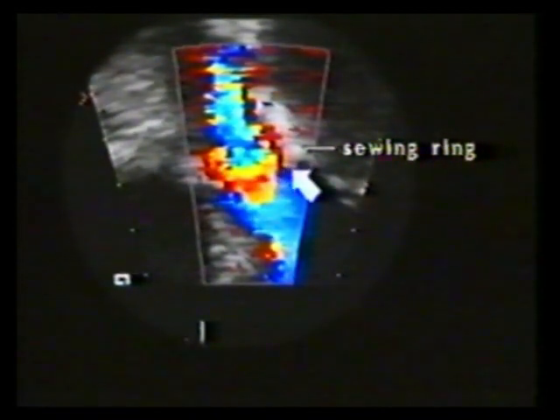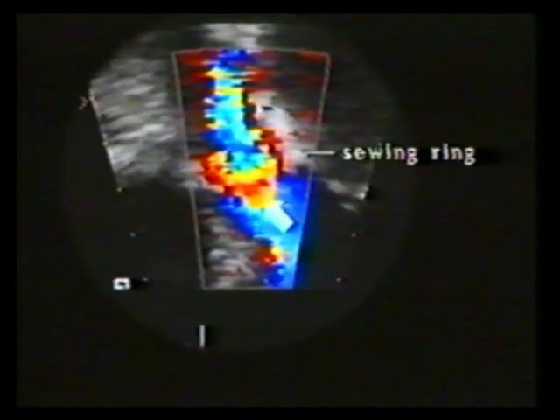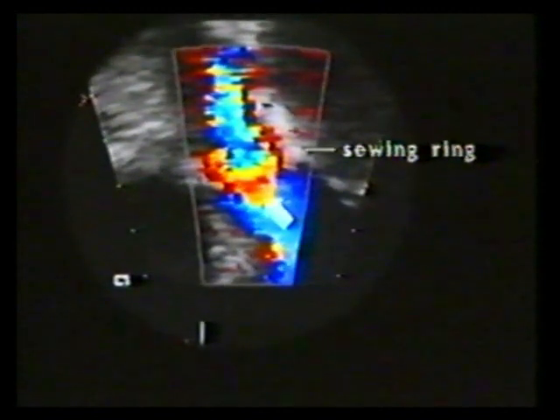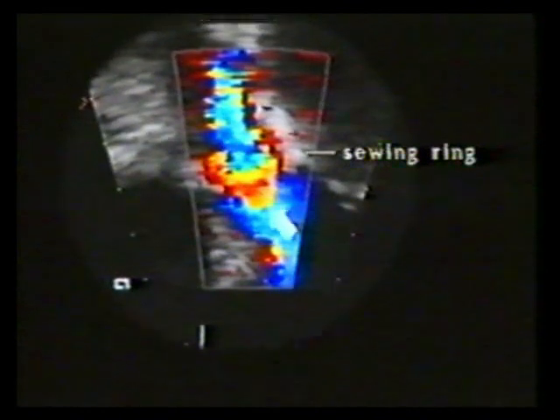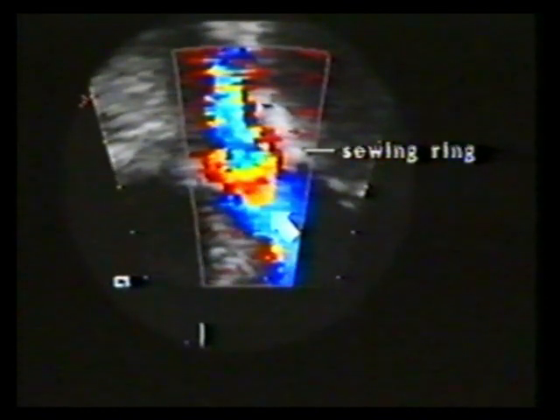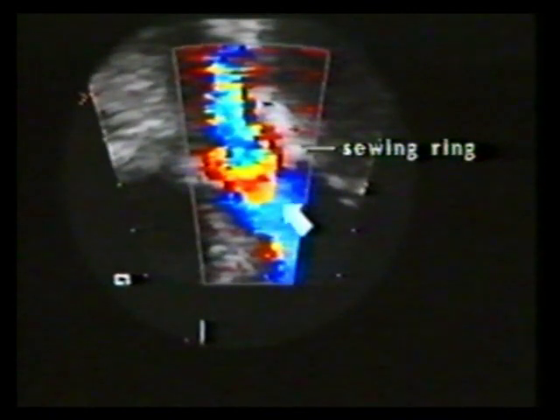There are dead water zones near the edges of the ring, which result in acceleration of blood in the central zone, as indicated by the color aliasing. Note that this begins almost 1 centimeter proximal to the sewing ring. For the continuity equation calculation of aortic valve area, we want to measure the LVOT velocity proximal to this zone of aliasing, back here where the velocity is more uniform across the entire LVOT diameter.